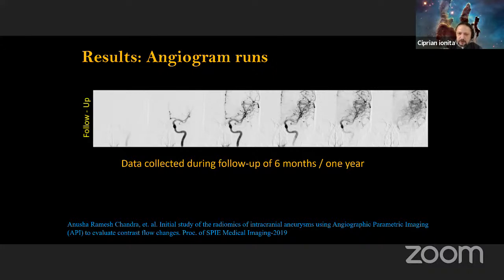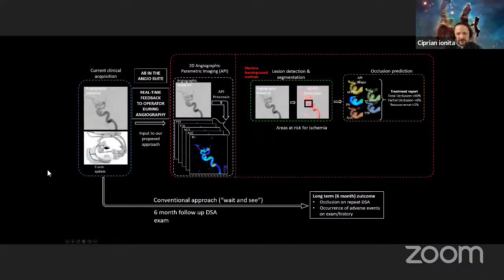The idea is that if you deploy too many, or you push too much, you might rupture the aneurysm, or you might end up with a coil coming into the main artery, and then you might have to deploy a stent-assisted coil embolization that will put the patient again onto antiplatelet therapies. So there are a lot of implications with regard to those deployments.